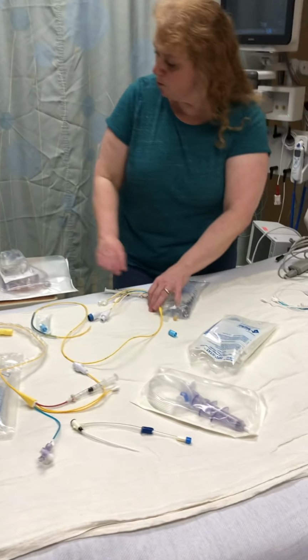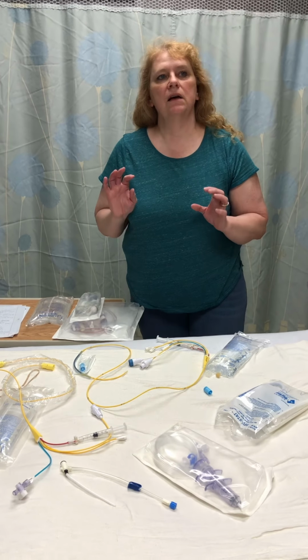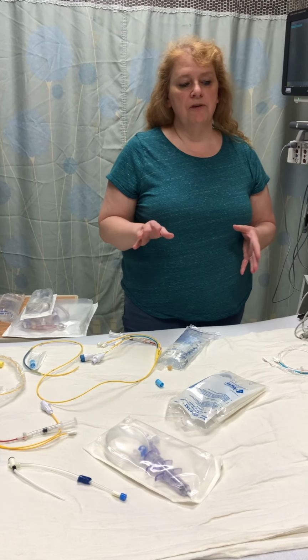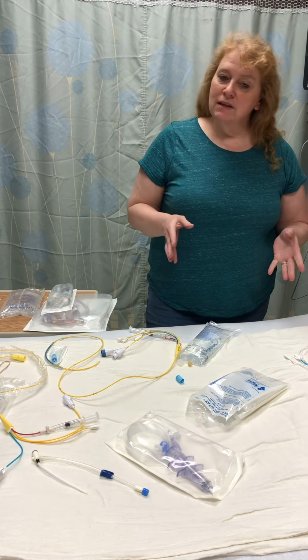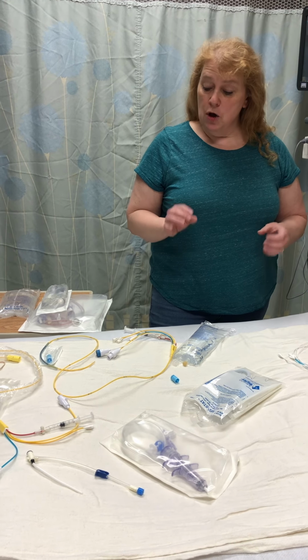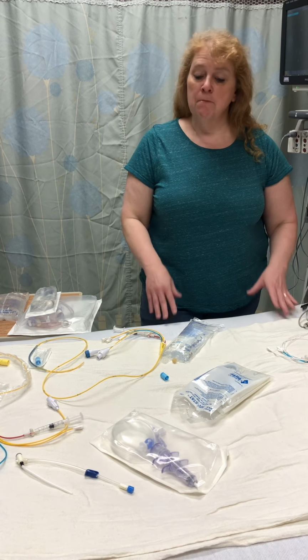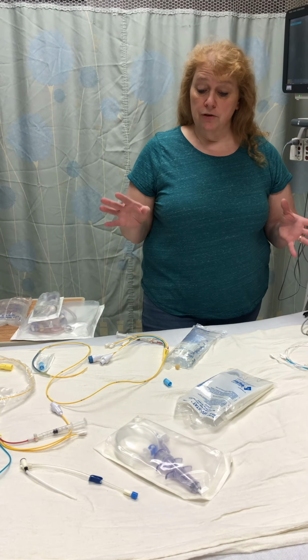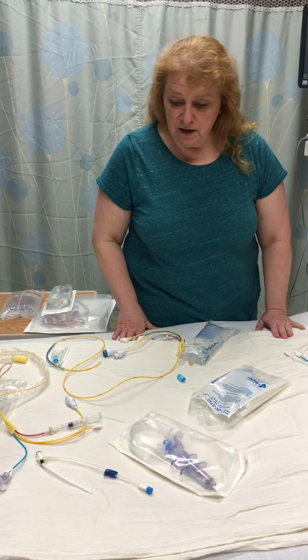So when they insert the Swan is the best time to get a feel for what the different waveforms look like. Most of the time they're going to come back with the Swan already, but when they insert the Swan at the bedside, it will be like inserting another central line with a couple of different things to it.